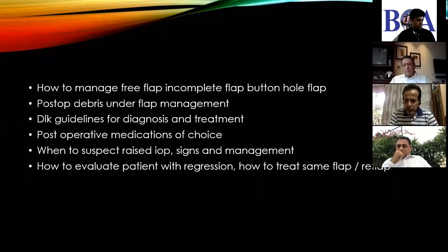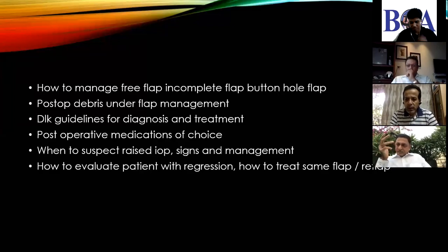Yeah, so I think the only thing I would like to add is this is the one time when the marking of the flap would have been extremely useful. Though as Baja was talking about the tonometer, which went by the wayside, most surgeons have given up marking of the cornea. Because when this free cap is put back, you can get bad astigmatism if the orientation is not proper in spite of being a good fit. And so when to mark is also important. Marking just before taking the flap.